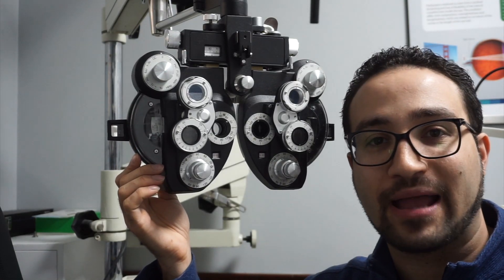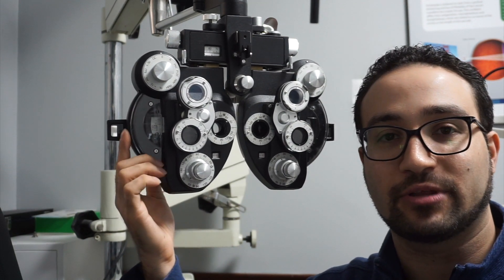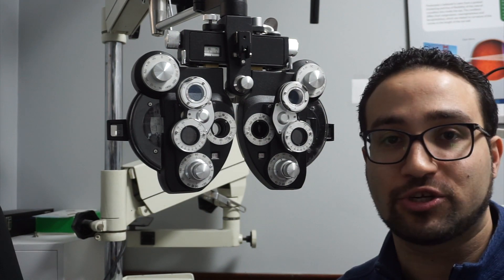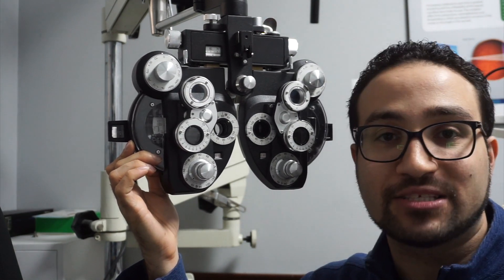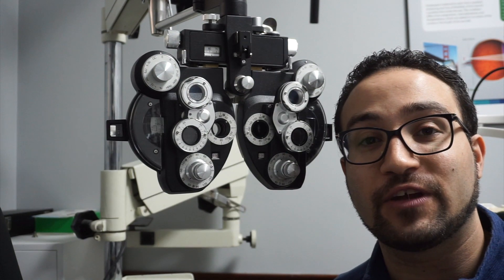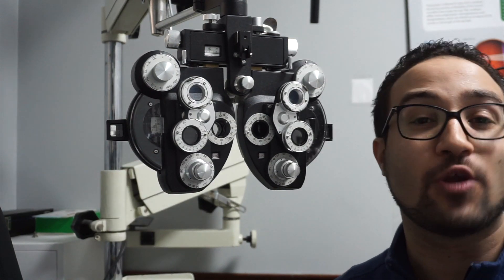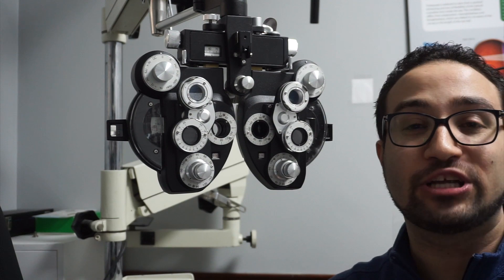I begin to introduce a little bit of minus diopters into the prescription and let the patient tell me when they're able to read the chart clearly — specifically that 20/30 line. Once they reach that, we begin asking: which is better, glasses number one or glasses number two? We also pay close attention to whether there is actual improvement to the vision, because some patients will gladly accept more minus yet it doesn't improve their vision. It's a close teeter-totter — as we increase the minus, is their vision getting significantly better?